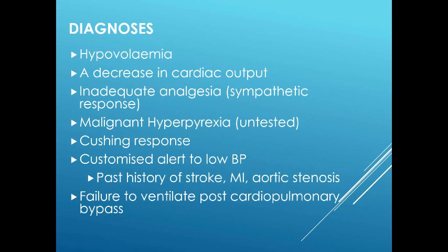These are the diagnoses programmed to date. Hypovolemia is suggested when a significant change takes place in the blood pressure, heart rate, and pulse volume, and is reinforced if the respiratory-associated pulse pressure variation is high. This is only operative in the presence of invasive pressure monitoring, IPPV, and an undamped arterial trace.